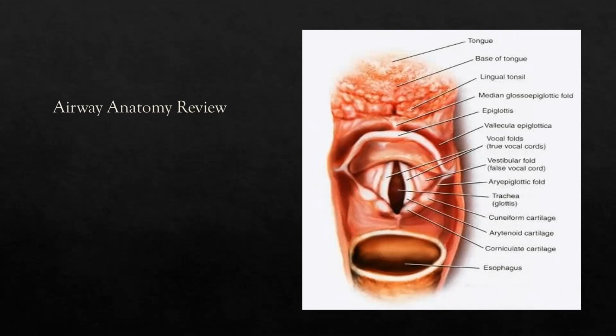One of the things I want to encourage is, if you can't see those true vocal cords, if you can't see the opening of the trachea, don't just stick whatever. We as advanced providers should not be just poking and hoping. We want to make sure that that tube is going in.